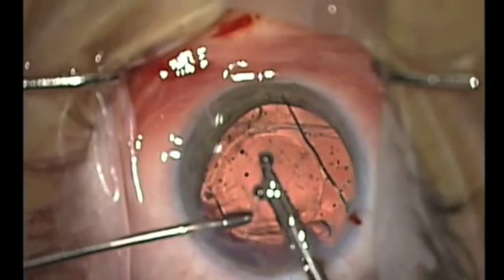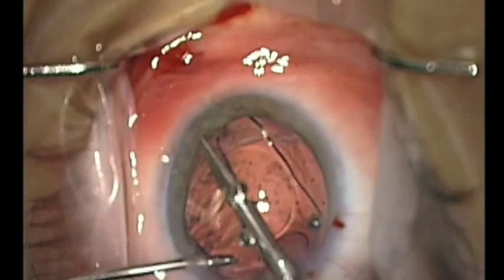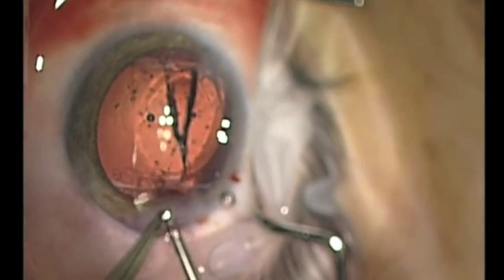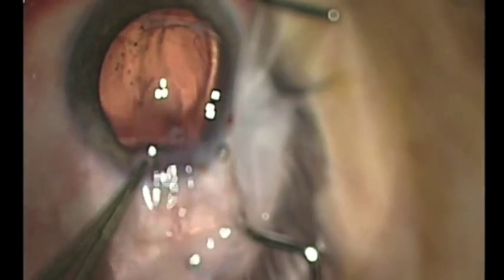A bimanual technique is used with these coaxial micro instruments in order to bisect the intraocular lens before explantation. Another option is to divide the lens into four pieces in a similar fashion.